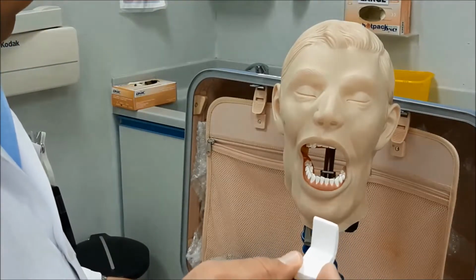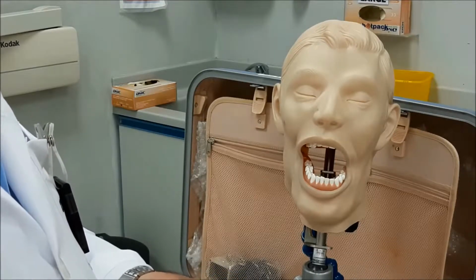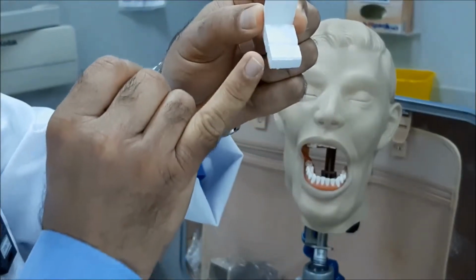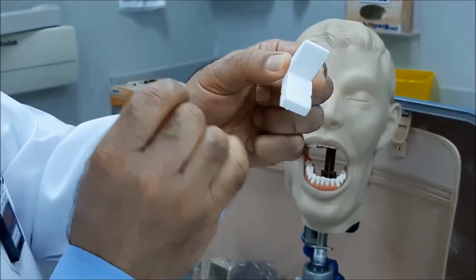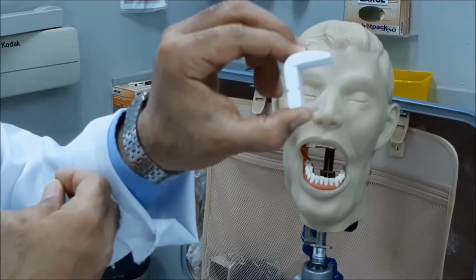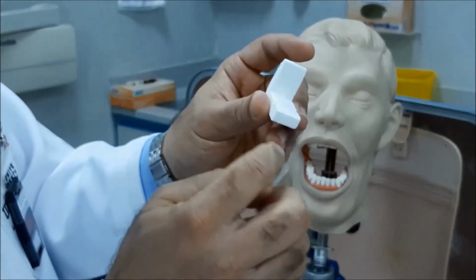And again, just like we did in the previous demonstration, we will use the smaller size film for purposes of demonstration. So in this type of sensor, you will find here that there are two areas on which the patient is going to bite. 1, 2. There is a slot in between them, and there is a slot over here that will allow you to insert the film or the phosphor plate sensor. So this back side of the holder, it will support the film.